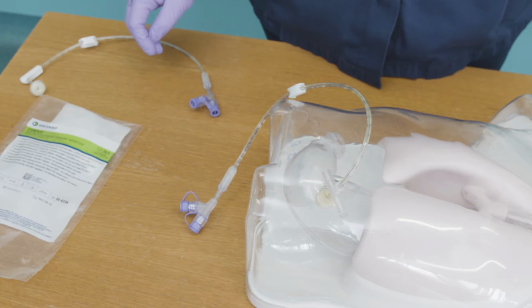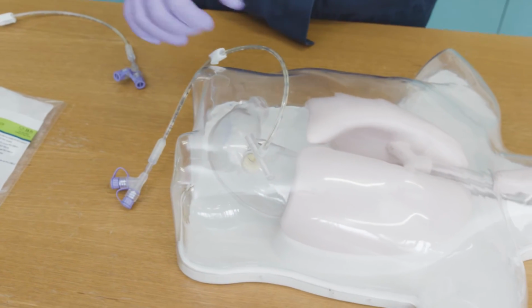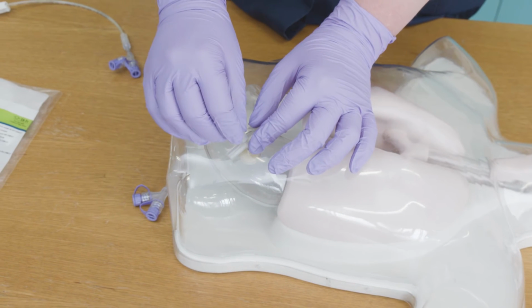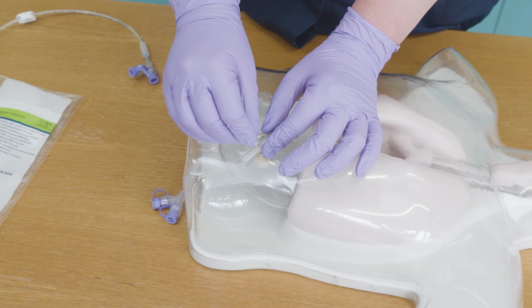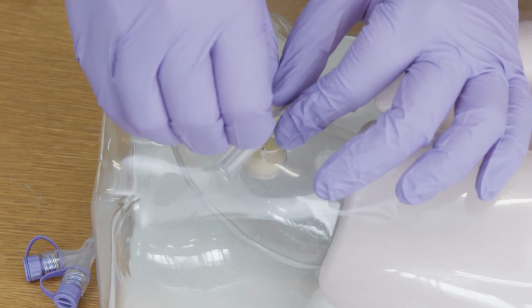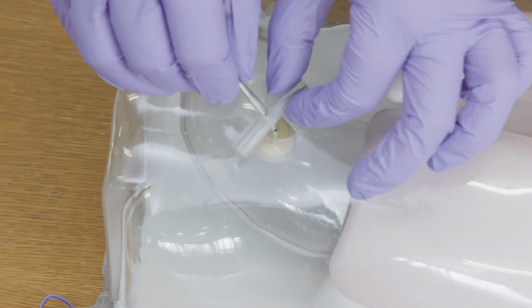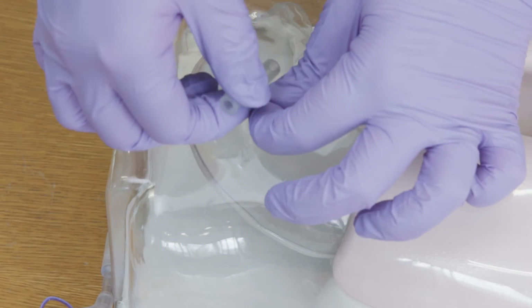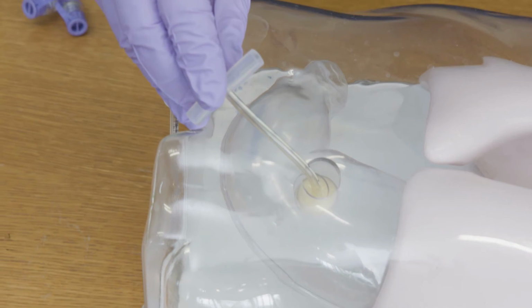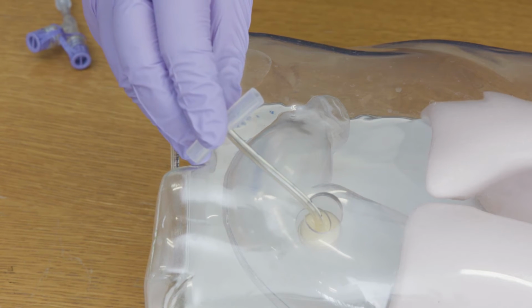To advance a Corflo PEG with a Tbar external fixator, you will need to move the Tbar away from the skin by approximately 2 inches or 4 centimetres, an average thumb length. Do this by first moving the cuff and then the Tbar. If the tube or stoma site requires cleaning at this point, do so using gauze and water.